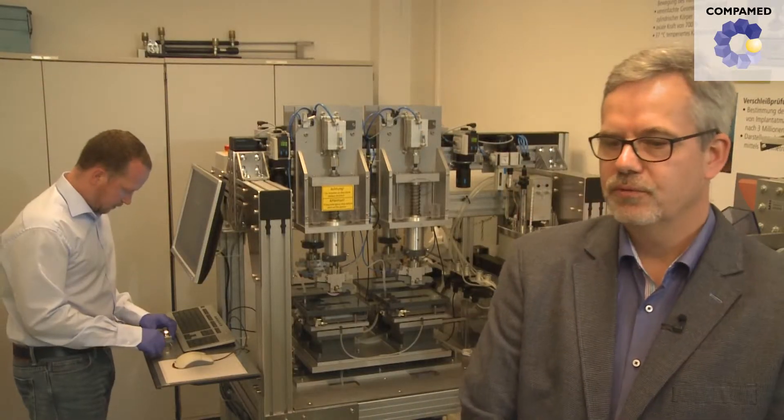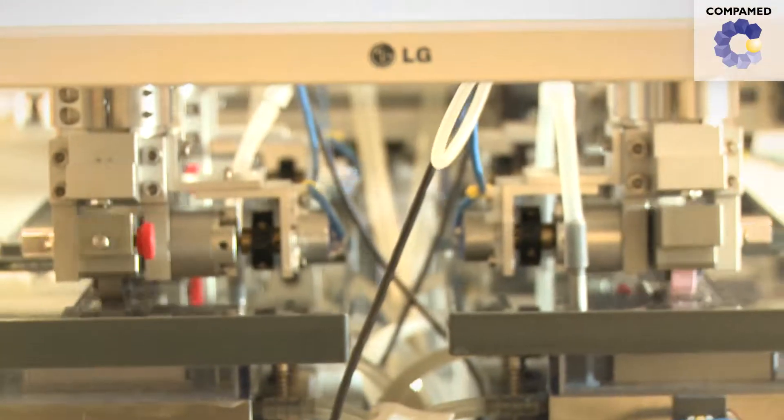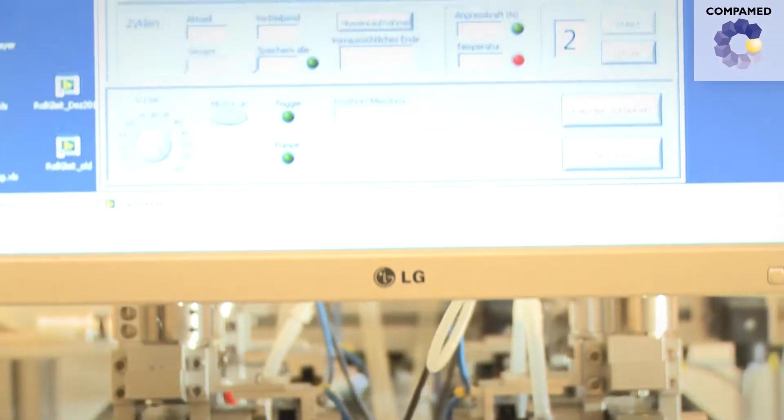In our test facility, we examine simplified geometries under motion and strain similar to what happens in the knee, to make sure that the wear and tear that would take place in the knee joint would also be as low as we envision.